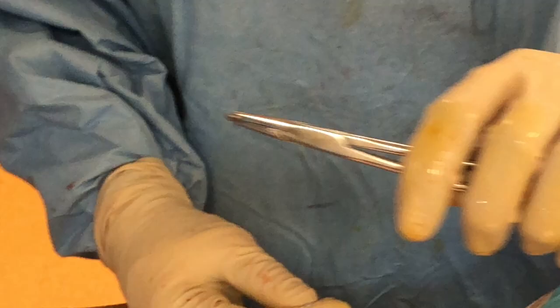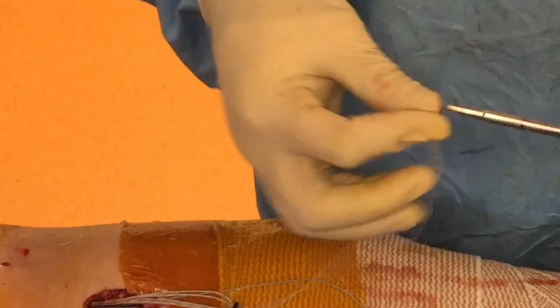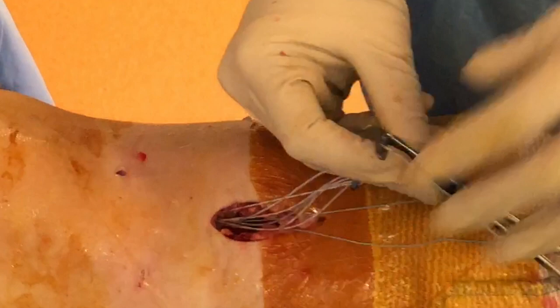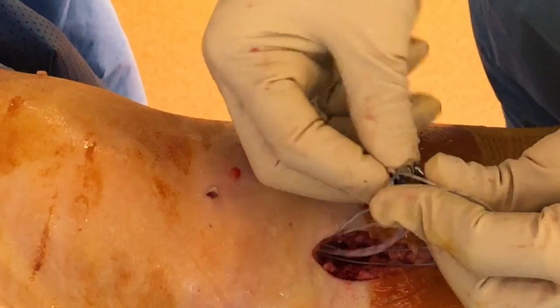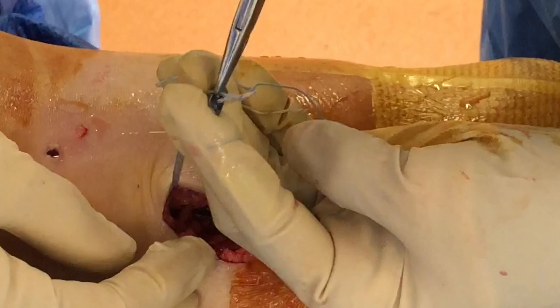We are going to secure — this is the extender button for the ultra-button, so we put it through here because we need a bigger interference between the orifice and the graft string. You can see it sits beautifully within there, and then we are going to feed the other two sutures through.